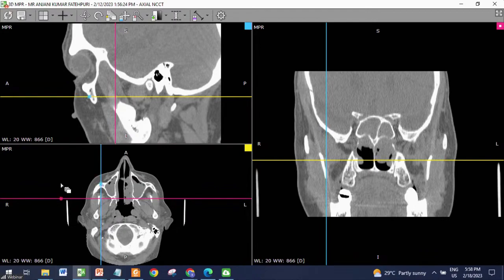While entering the sphenoid, the debrider blade should be towards the septum, medially, safe. Can you change to the endoscopic picture?